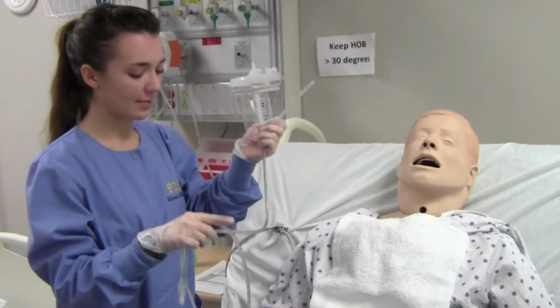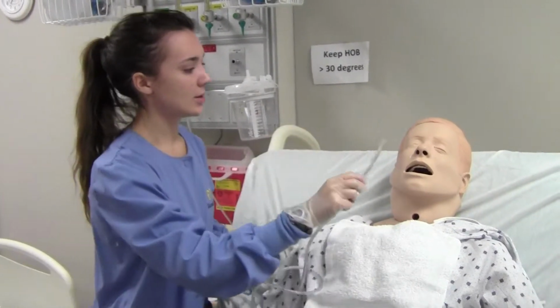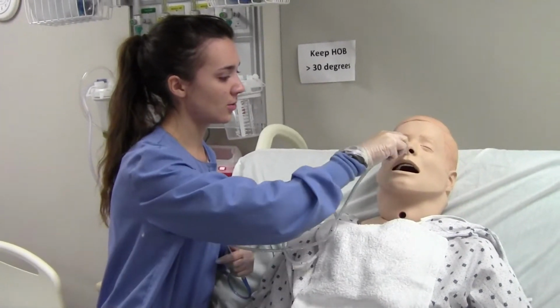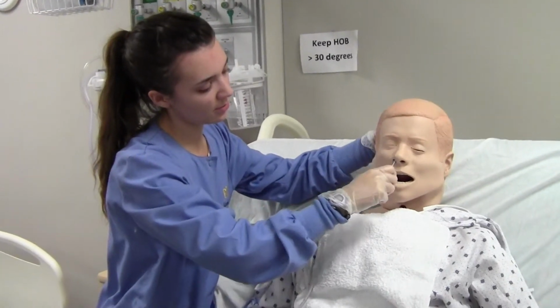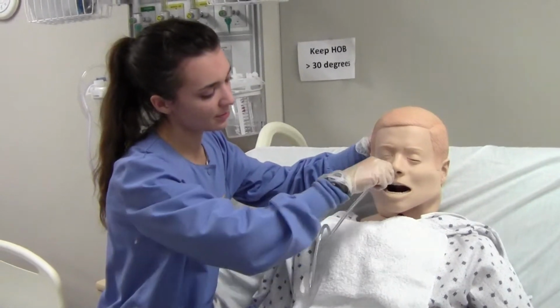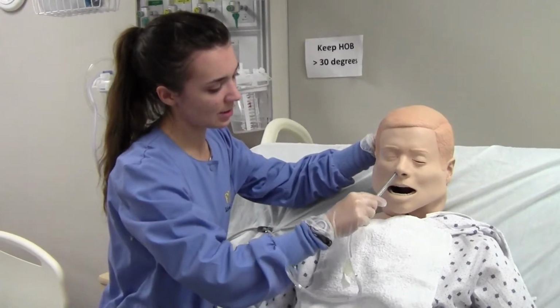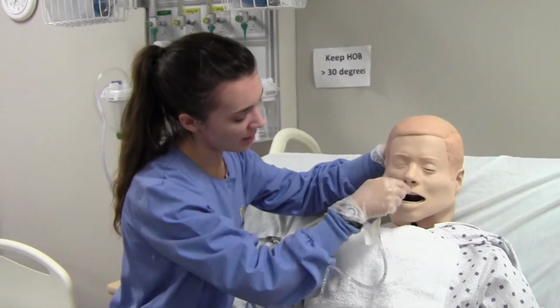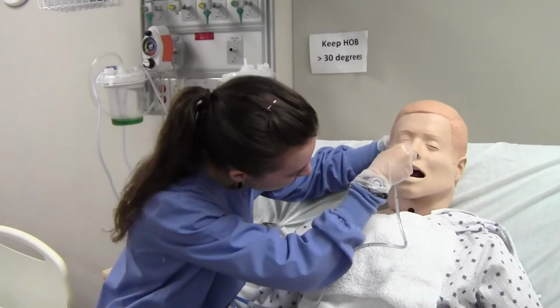We're going to begin. Okay, so here we go. So we're going to insert it in, and insert it in. Oop, gagging. Alright, so I'm going to ask you to tilt your head forward. We're going to pull back and grab your water. You're going to sip, put it in, sip, put it in, sip. Doing a great job. Put it in, sip, put it in, sip, put it in, sip, put it in.